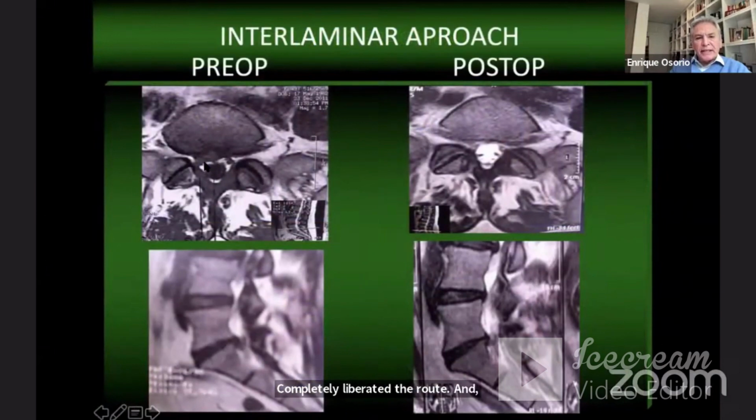You can see this case in the pre-op with this posterolateral herniation, and this is the post-op of the case, the pre and post-op.